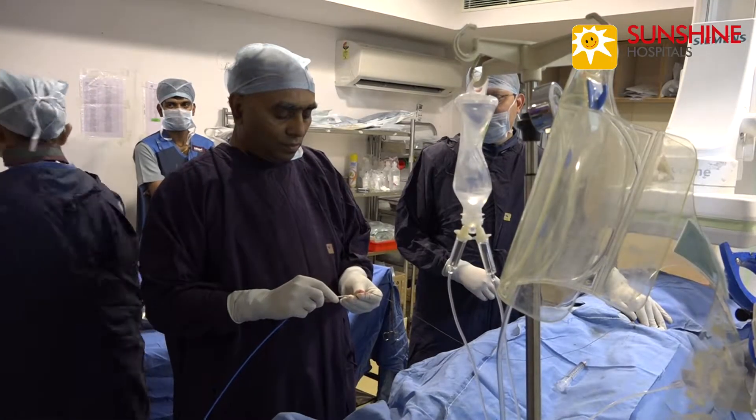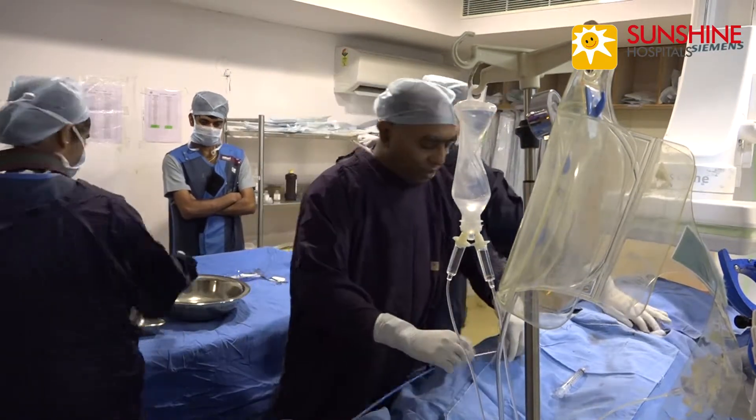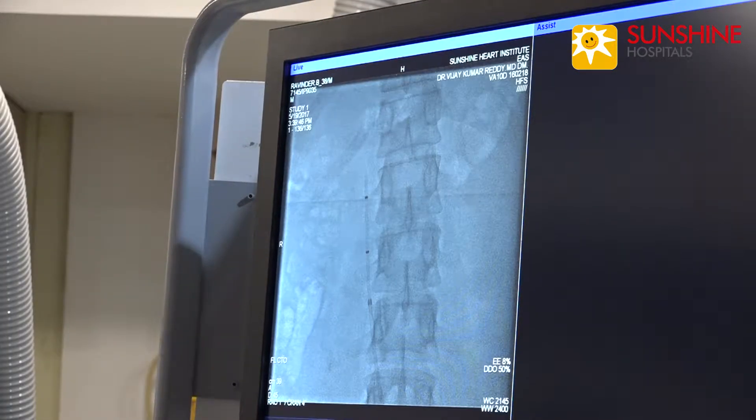Now we are advancing the filter sheath. Now we are keeping the sheath in the infrarenal position.